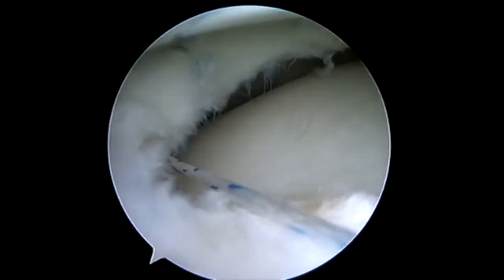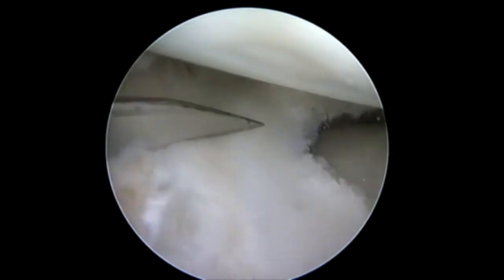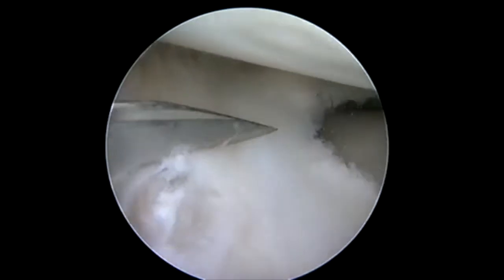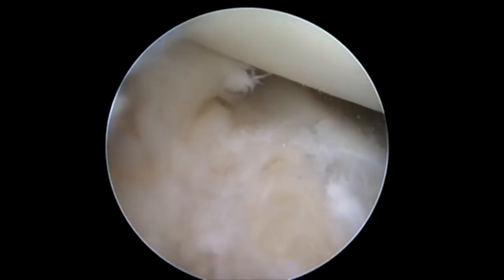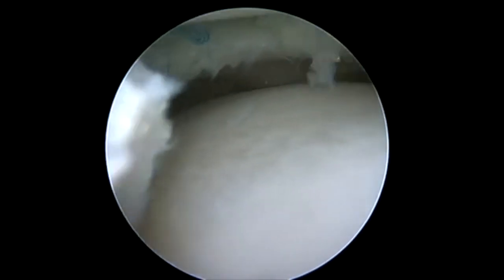Again, we're tying barrel stitches for this horizontal split. But you can see my knife coming in through my lateral portal. I'm going to take my number 11 blade and incise just below the meniscus into the capsule. This allows me at the meniscal capsular junction to either pass suture underneath the meniscus with a crab claw type suture retriever or pass the NovoStitch jaw into my capsular rent.